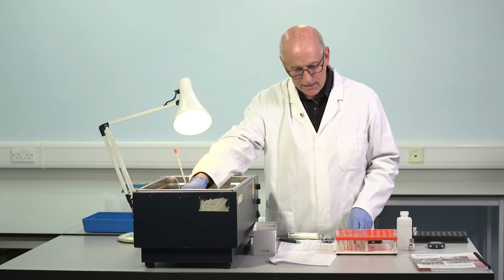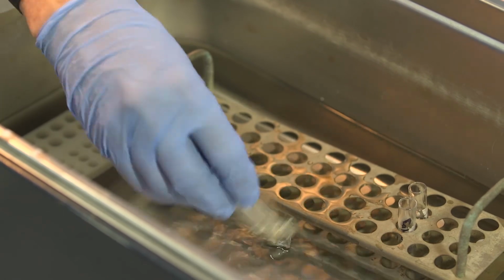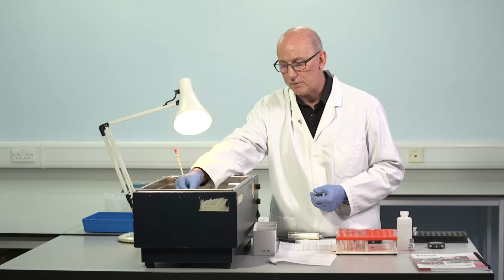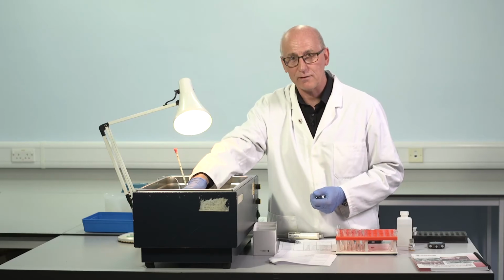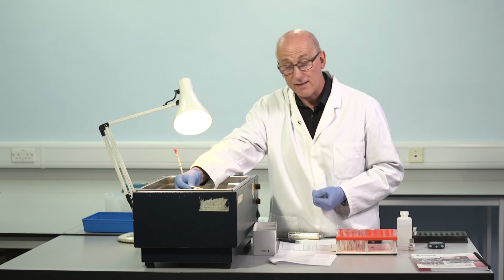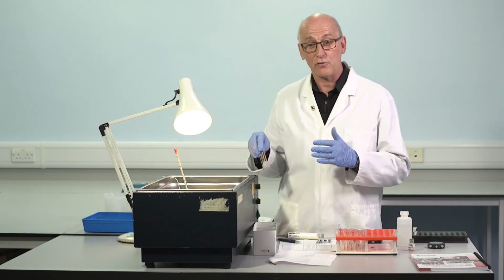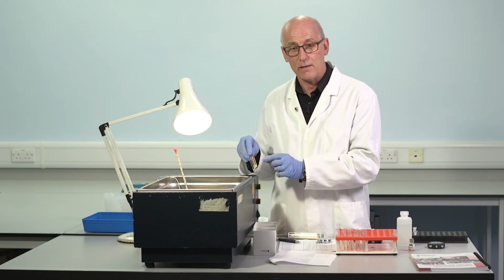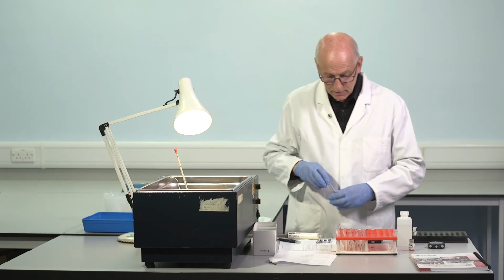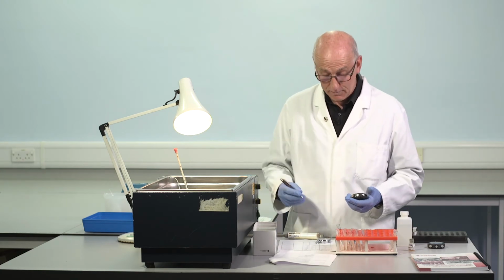If we were running this assay on an autoanalyzer, in which the test and standard are analysed at the same time, then it's not so important because we don't see the same opportunity for drift in the assay system, for change in the reagents. If there's a delay in the time, and there is for most analyzers, then we should also finish with a repeat calibration in the same way that we began the assay with a calibration curve. So this is a repeat of the standard that we began with.